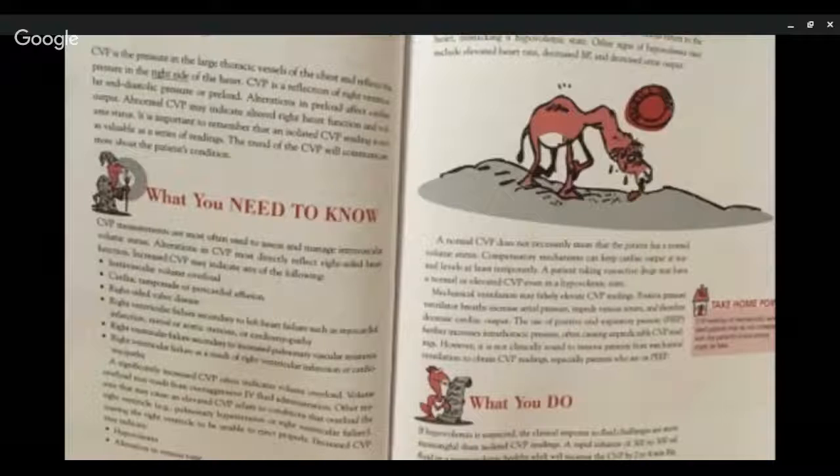CVP measurements are most often used to assess and manage intravascular volume status. Alterations in CVP most directly reflect right-sided heart function. Increased CVP may indicate any of the following: intravascular volume overload, right-sided valve disease, right ventricular failure secondary to left ventricular failure or left heart failure, such as myocardial infarction, mitral stenosis, or cardiomyopathy.